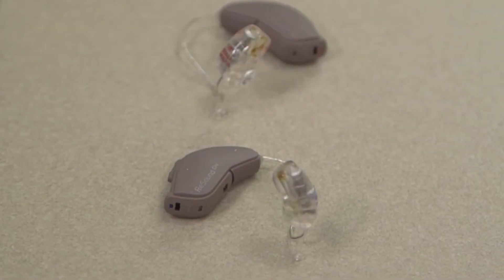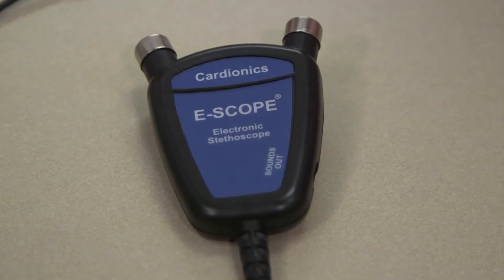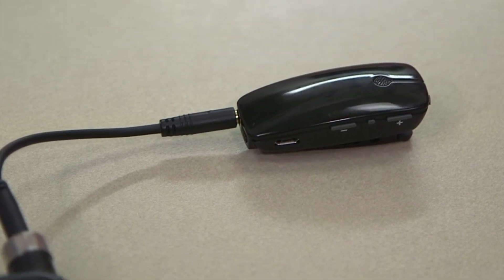What you'll need is an iPhone, GN Resound hearing aids that have Bluetooth capabilities, a Cardionics eScope which has Bluetooth available in it, a short audio-to-audio cord, and a GN Resound multi-mic.